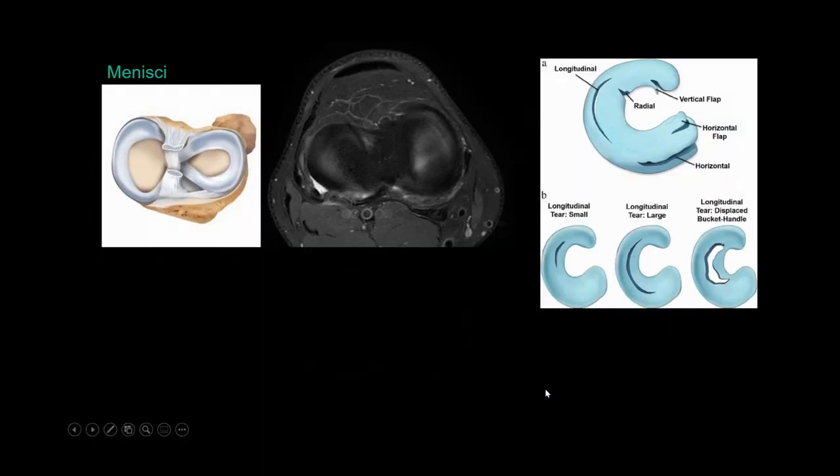Okay, so Yeong nicely went through most of the types of meniscal tears that we can see. This is just a very nice graphic. If you're lucky enough and your MR technologists are friendly enough to you that day, they will do a nice axial sequence through the meniscus, and you can see roughly the medial and the lateral menisci on this image here. Okay, and this axial image I found has been a lifesaver at times, because sometimes there are tears that you don't see on a sagittal or a coronal sequence, but do appear on the axial sequence.